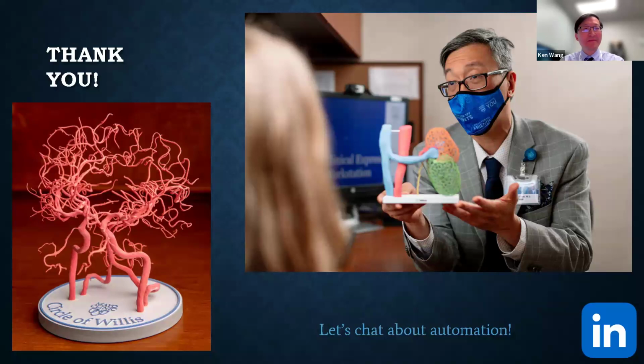Great. And then again, there was that second question about trauma cases. Can you speak to the time for printing in the context of trauma? Yeah, so specifically with trauma, typically when we're asked for models, the deadline is not immediate. The deadline is a couple of days because the patient may have swelling that needs to decrease before they go in to do reconstruction. So we typically do have a couple of days, but the design piece doesn't become a barrier anymore.